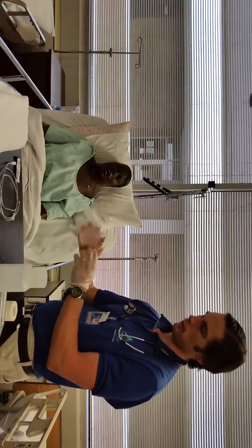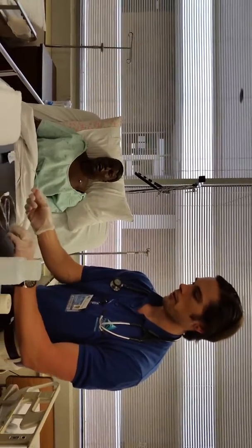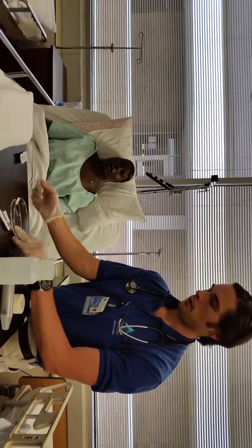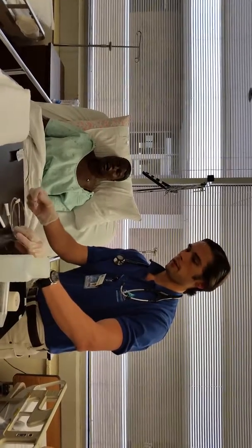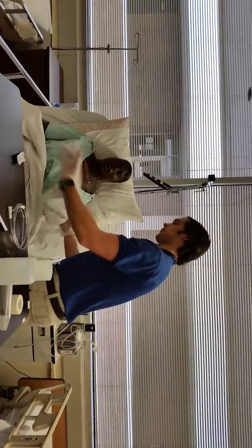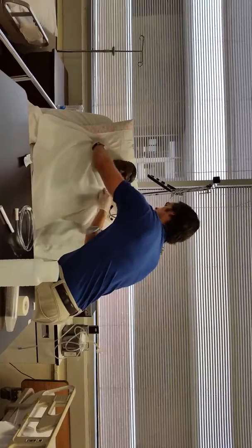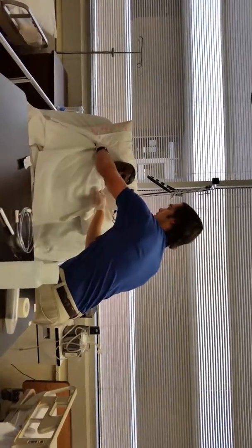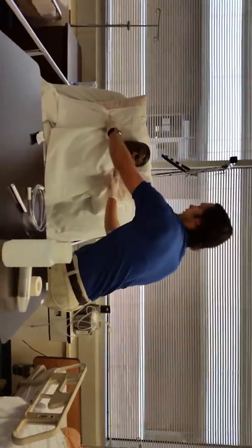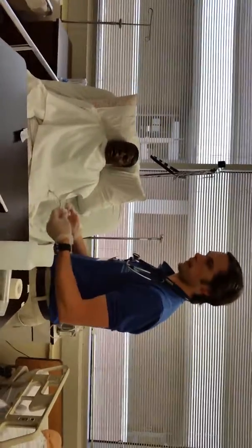I'm going to lube up the first 4 inches liberally of the NG tube. Set up a towel for the patient in case there's any vomiting or secretion. All right, so I'd warn the patient about what's going to happen. May gag, may not.